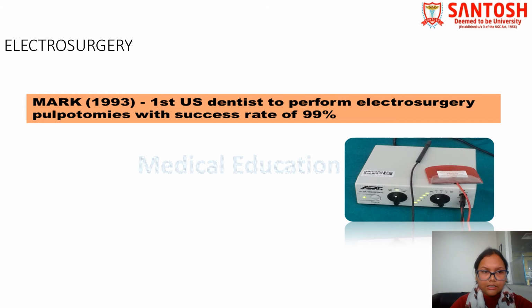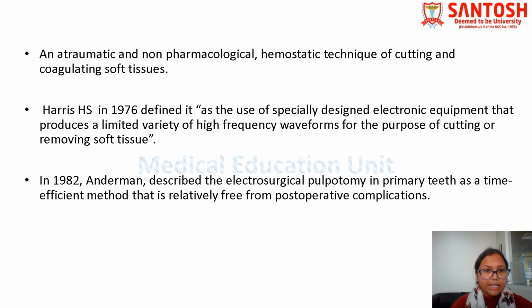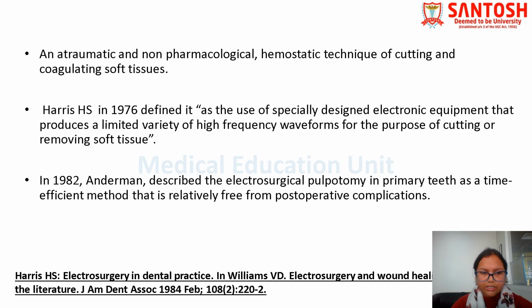So again, electrosurgery, it is a single visit devitalization process. It is an atraumatic and a non-pharmacological hemostatic technique of cutting and coagulating soft tissues. So it is defined as the use of specially designed electronic equipment that produces a limited variety of high frequency waveforms for the purpose of cutting or removing soft tissue. Electrosurgical pulpotomy was described in primary teeth as a time efficient method that is relatively free from post-operative complications.